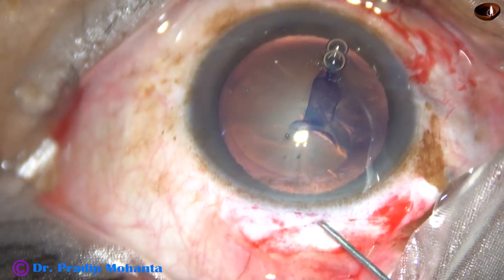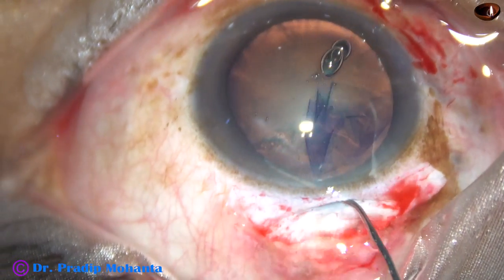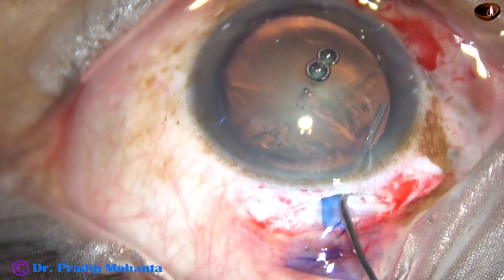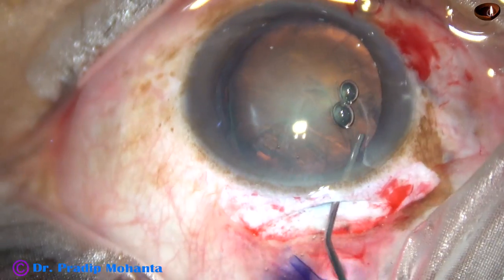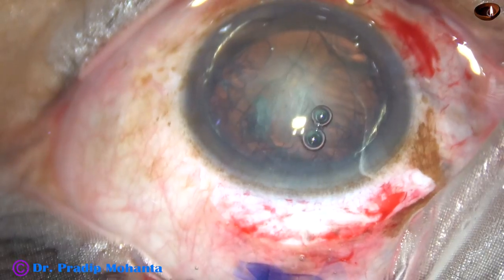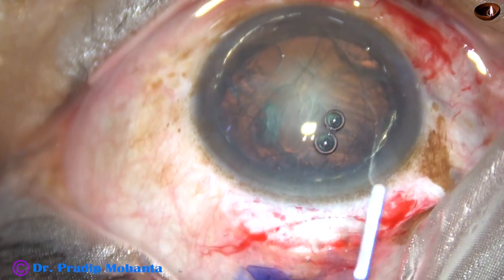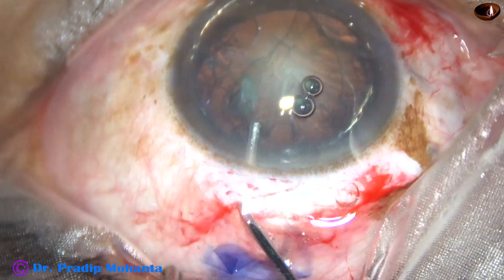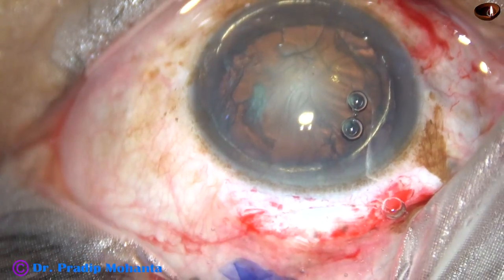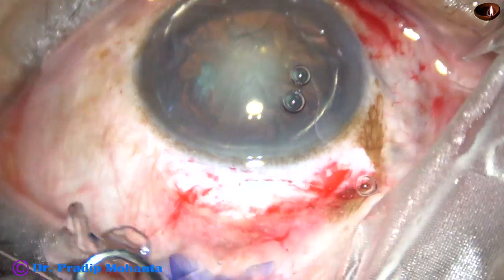Now hydrodissection. Fluid wave is passed — injected at one o'clock and then at nine o'clock. The nucleus has come out of the capsular bag because the size of the rhexis was about six millimeters. Visco has been injected both in front and behind the nucleus.